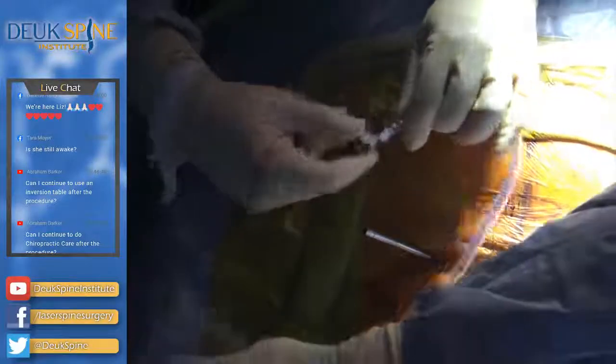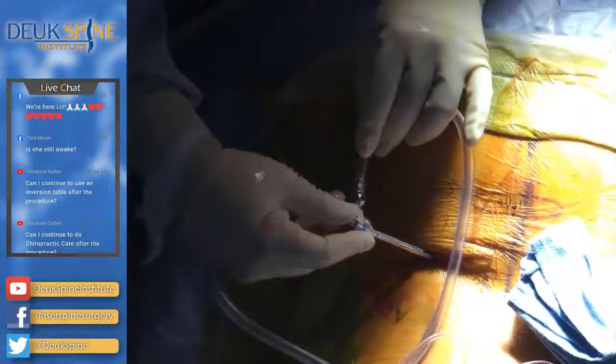All right, fluid adapter here. What do they say? Teamwork makes the dream work. Isn't that what they say?